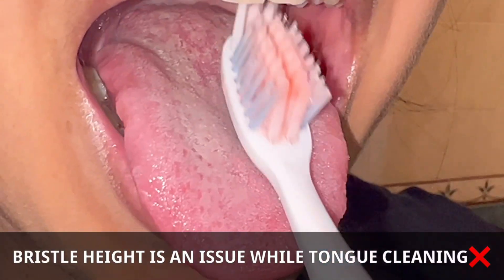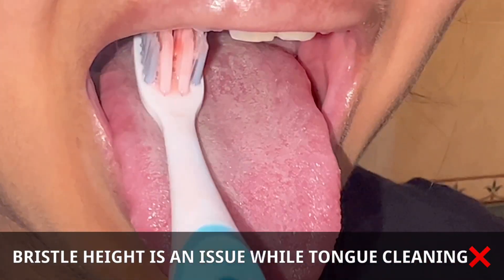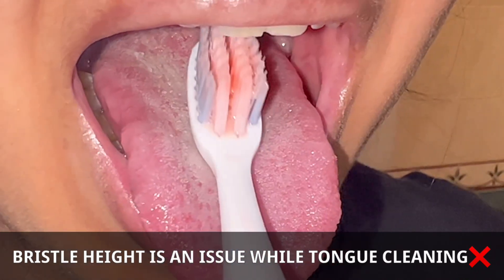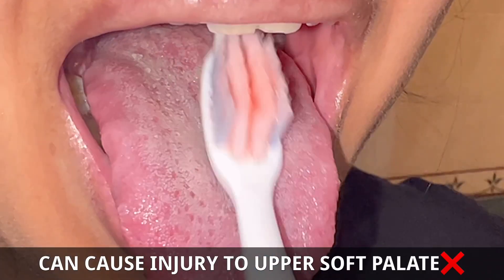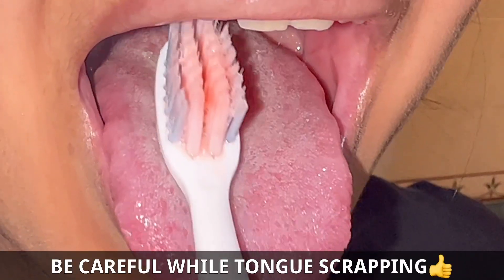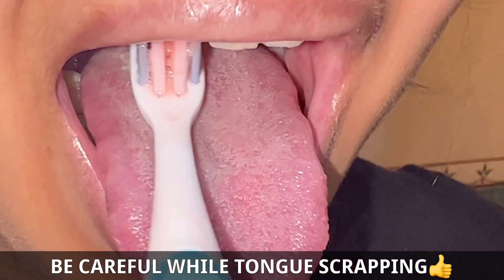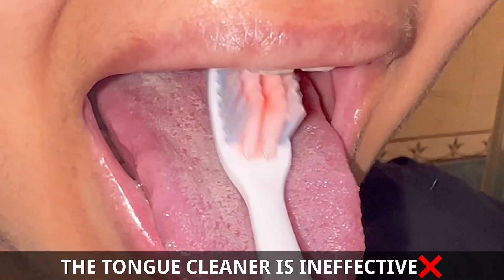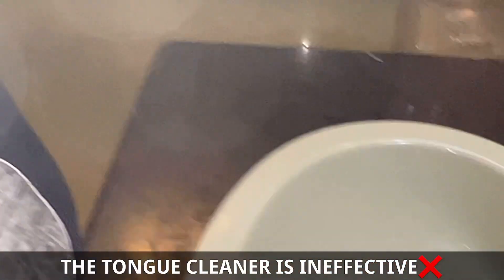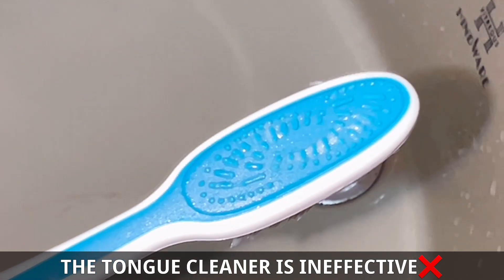Coming to the tongue cleaning, we get a good attached tongue cleaner to the toothbrush. It is clearly seen that these bristles might interfere with the hard palate or the soft palate, so they might create problems. However, these bristles are very thin and soft enough not to create any serious problems. But since the head size is very large, it might still cause issues. You can see there is nothing on the tongue cleaner — that means it is ineffective and cannot be used.